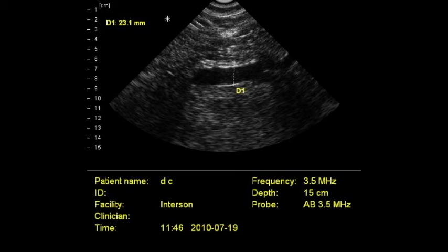The normal aorta measures three centimeters or less. If the outer diameter of the abdominal aorta is greater than three centimeters, the patient should be referred for workup and evaluation.